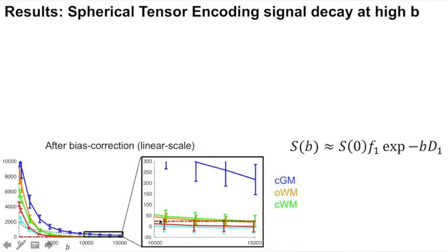It's kind of nice to look at it in that way, I personally find, because if you model the whole signal across all B values, you have to model all the compartments. And for example, if you make a wrong assumption for one compartment, it might bias all the other parameters. So it's kind of an alternative way to look at these compartments.